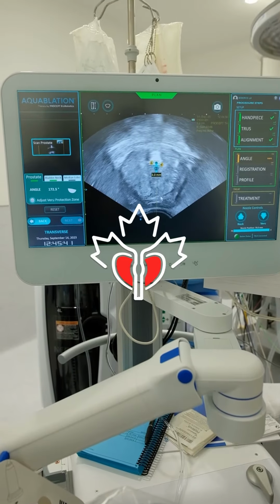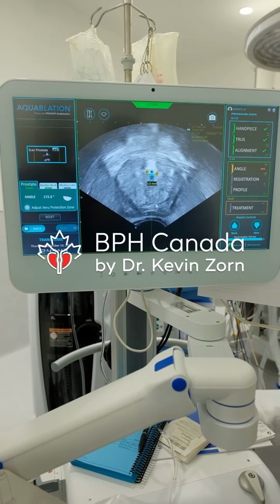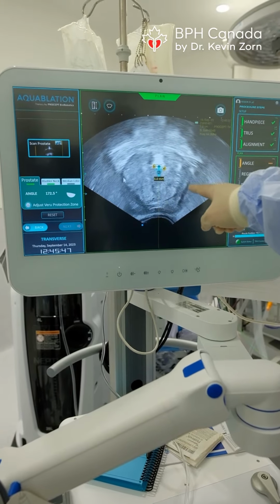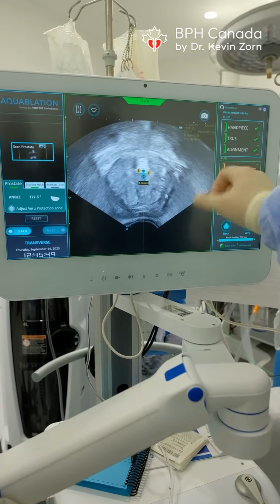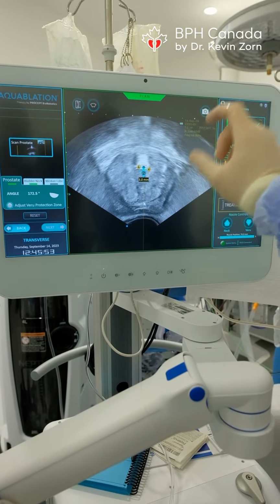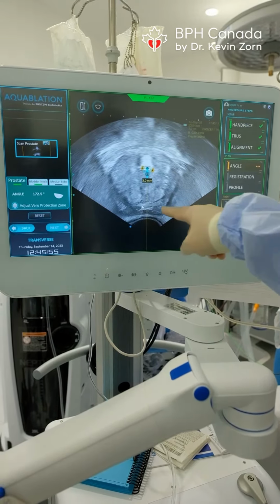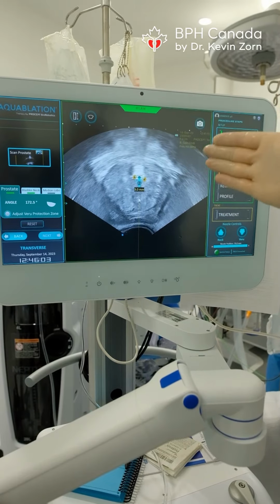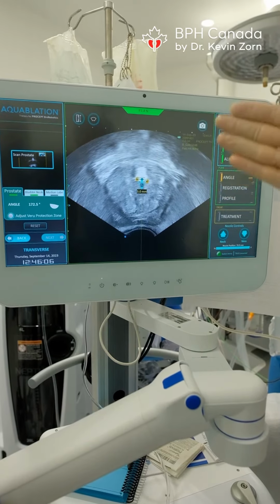So here we go, we're going to start our next part of planning the surgical treatment zone. You can see all here, the lighter, whiter gray is our transition zone. That's the BPH. All of that is compressing. The number 2 here is our urethra, where our scope is. Just beneath it is our peripheral zone. That's why we do rectal exams if we have prostate cancer, it's the zone where most cancers occur. So the upper portion, the Canada of North America, is our transition zone. We want to treat all that.